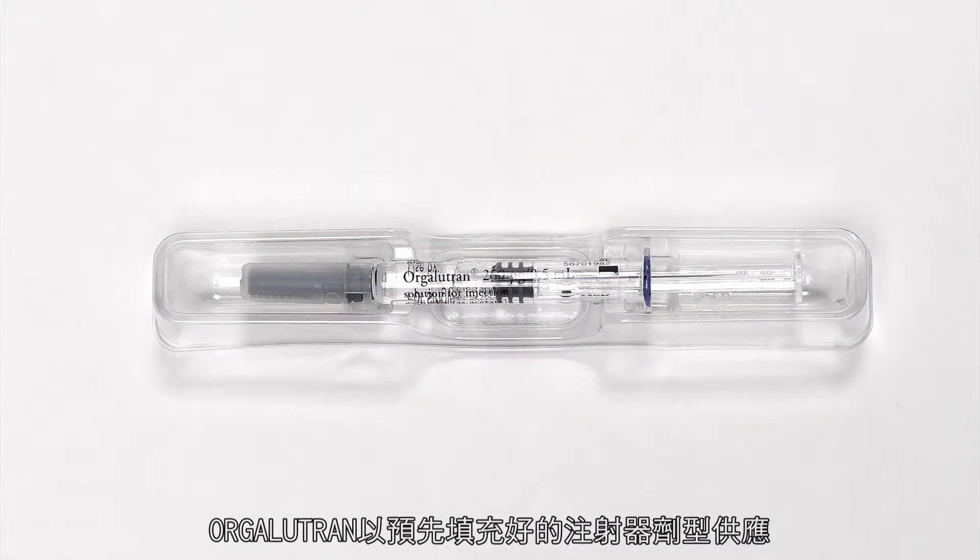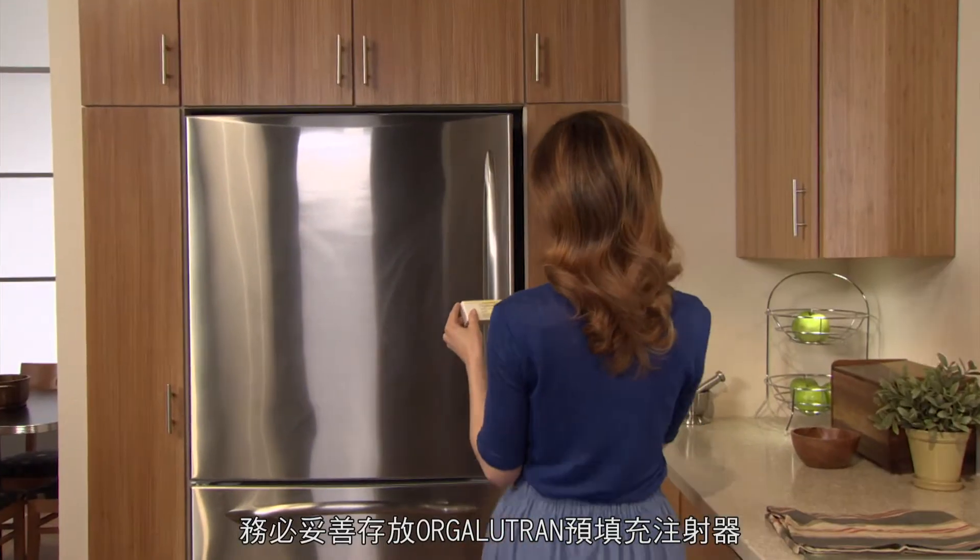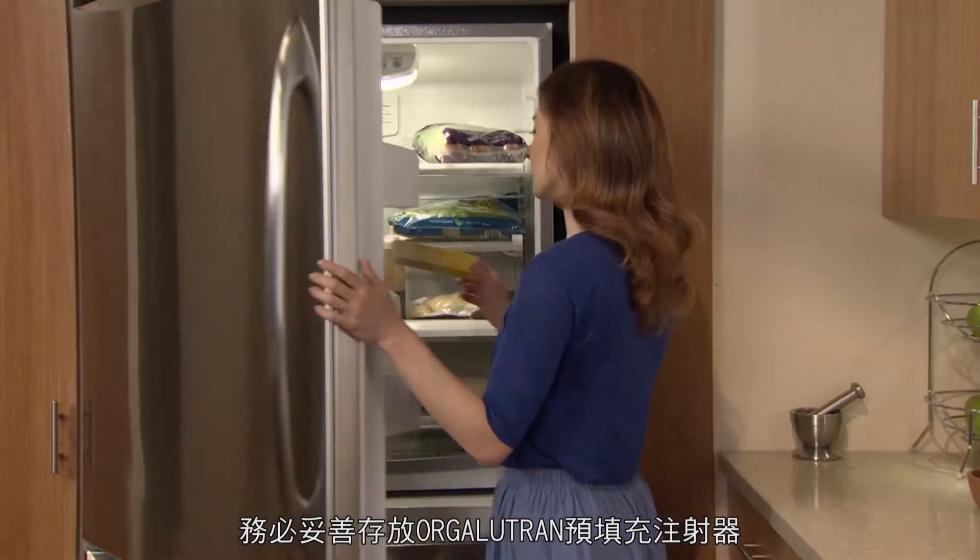Orgolutron is supplied as a pre-filled syringe. Keep the syringe in its tray. It's important to store your Orgolutron pre-filled syringes properly.